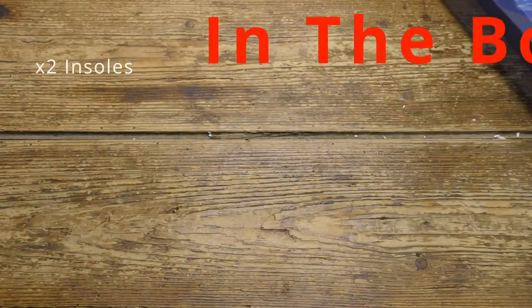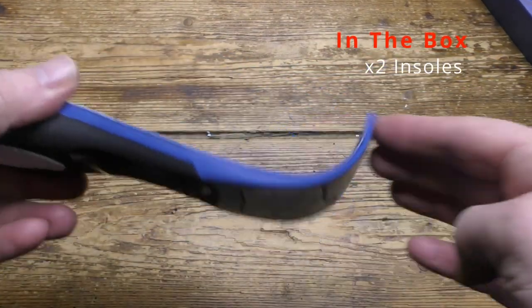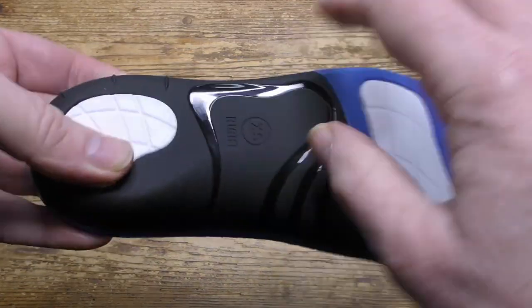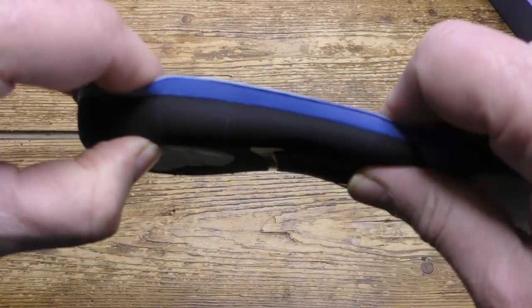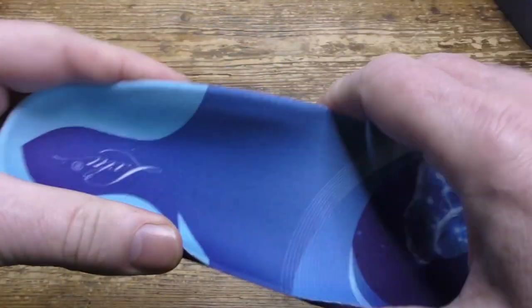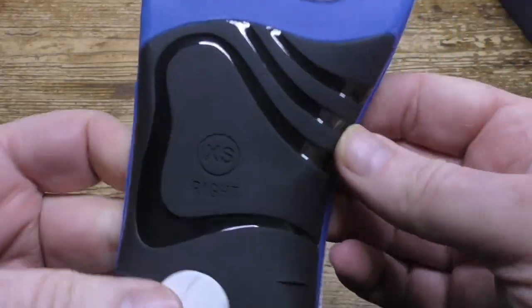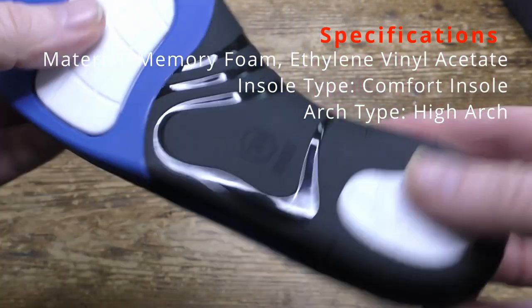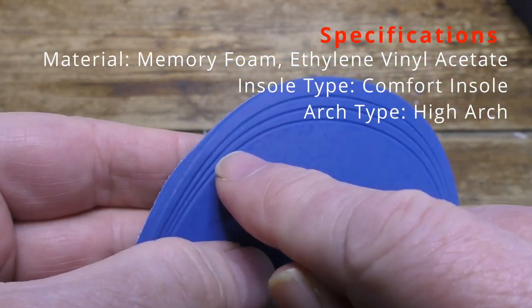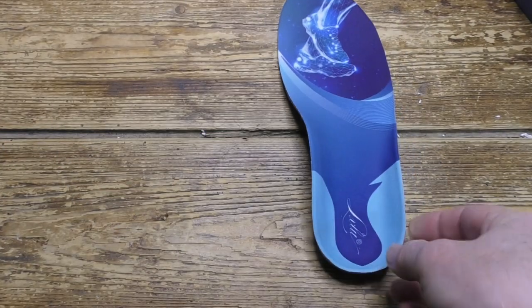Inside the box are just the two insoles — there's no instructions because they're already fully detailed on the box. The build quality seems fine; around the insole area it's really quite heavy duty and built to last. Around the toe area is just standard memory foam that can be trimmed to shape. The build quality feels excellent — these aren't a cheap item, they're well made.